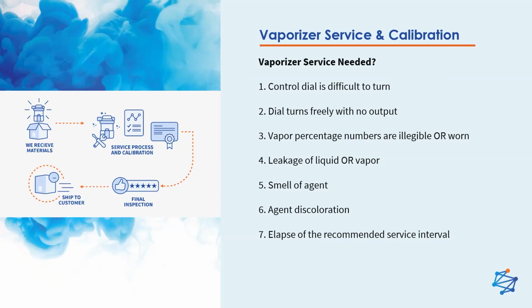There are some companies out there that will promote that their vaporizers are calibrated for life, or try to redefine what a vaporizer is and say that it doesn't need to be calibrated. But ultimately, if you're using a device that converts liquid anesthetic to a gas, an output test should be conducted annually and service and recalibration biannually. The vaporizer is a pneumatic device. It's a lot like an airplane, so it has Viton seals and joints. Like an airplane, we would never get on an airplane that's never been serviced. We would also never recommend using a vaporizer that's never been serviced.